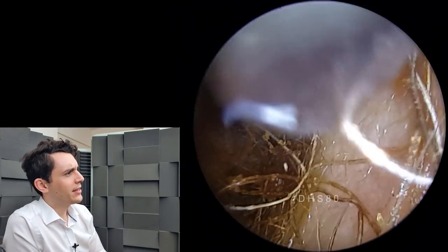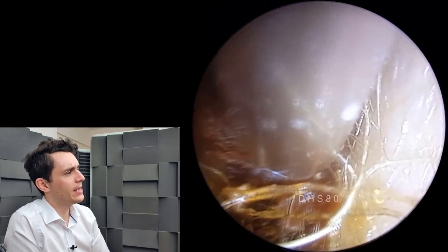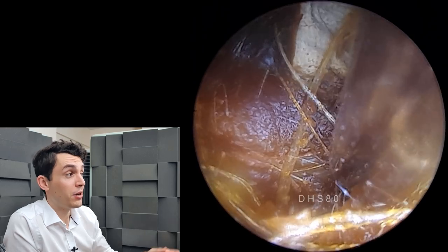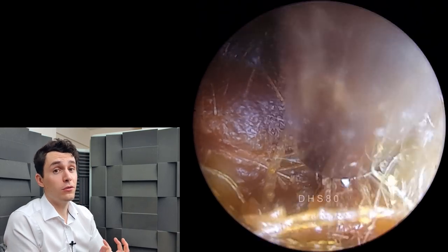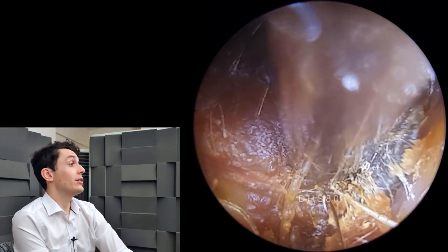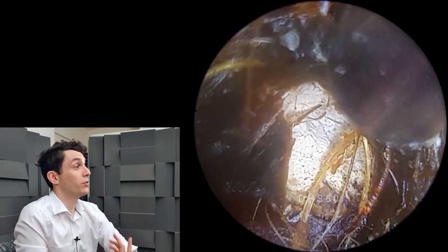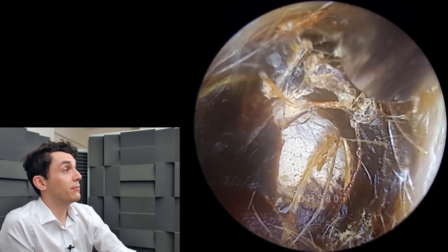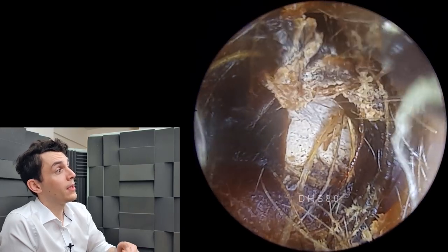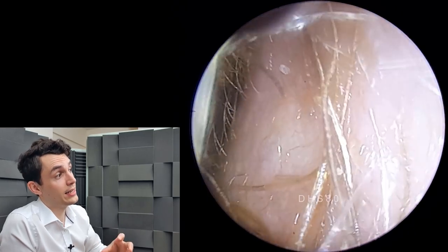We've got an unfortunate case here of a lot of tissue paper rammed fairly deep into the ear, so you can see this central reservation of white debris. Now when I first saw this I thought, oh is that some fungal growth or is it cotton wool? So I asked the patient — and I usually do talk to the patient during the procedure — I asked him what this debris could be, and he said it was tissue paper. So he had rammed quite a lot of tissue paper in there in an attempt to keep the drops he had applied in his ear.